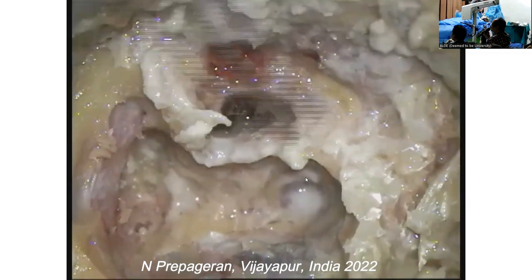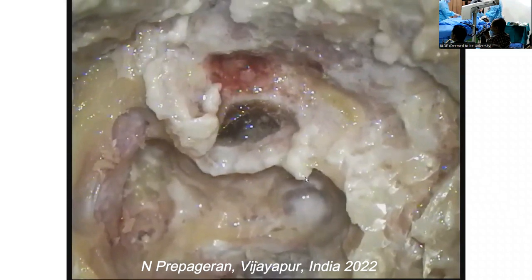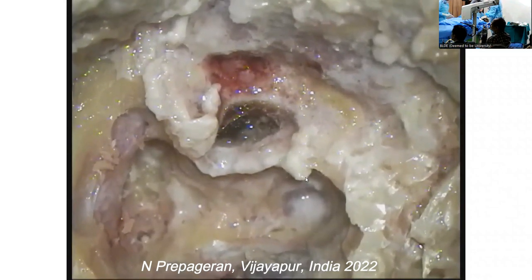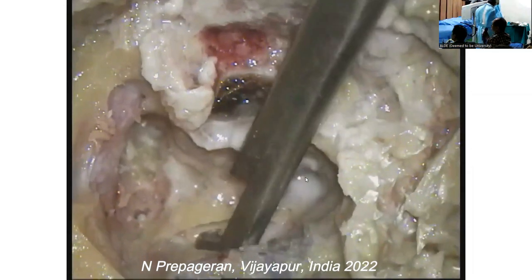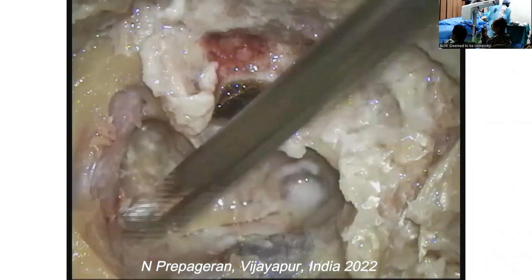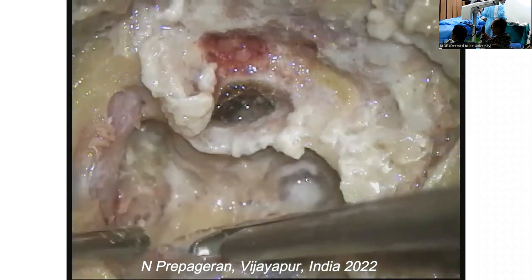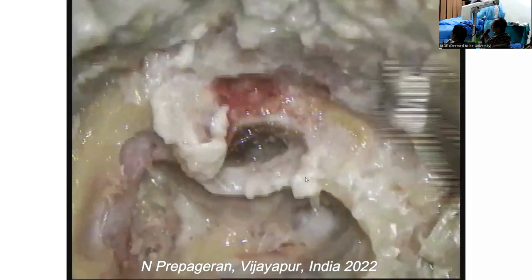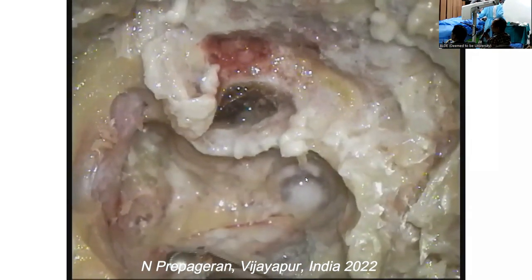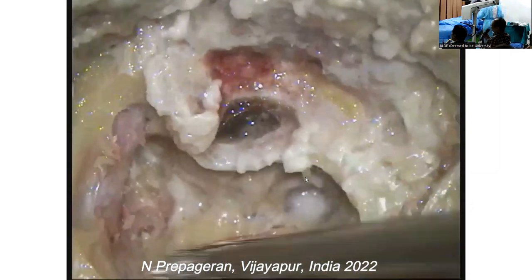Kerrison. Dura, open up. A small one. Oh, not this one, you need the 45 degrees. Yeah, I'll try this. It's a bit big, but we'll try. I think it's too big. You have a smaller one? You see how nicely you can remove? All you need is a bone nibbler. You see, guys?